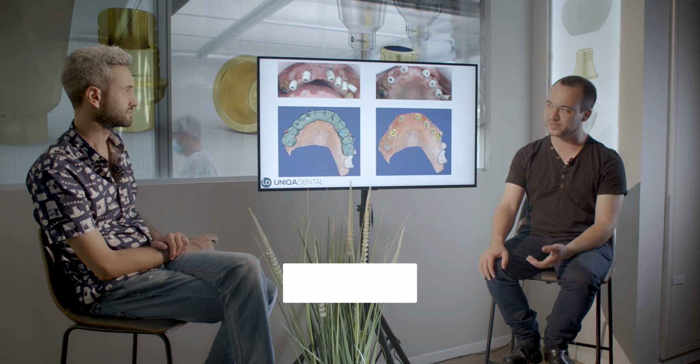If you're not sure, and you don't have too many places where you're not sure, use the implant level. Here, what was done is that we gave the technician the options to choose. You can collaborate more with your technician with the information that was sent to the technician. You have more information, you have more options. You just need to choose wisely what type of options you want to use, and don't give yourself too many options because you can get lost in so many options.